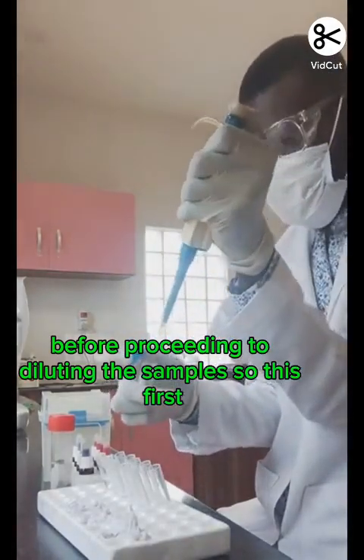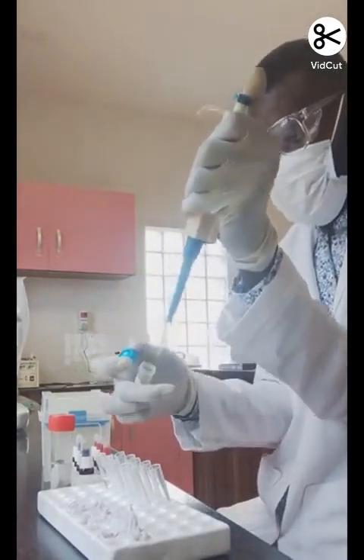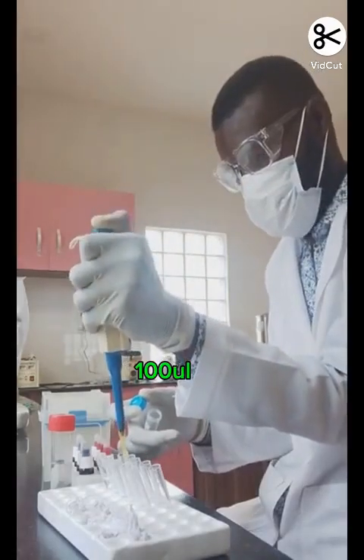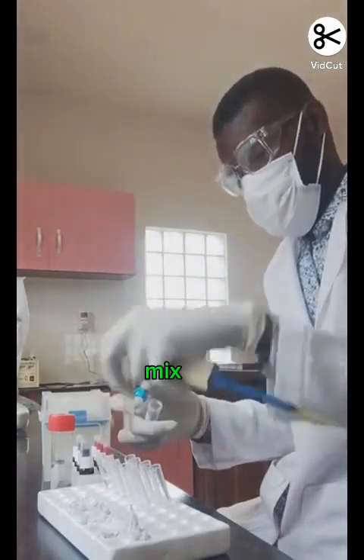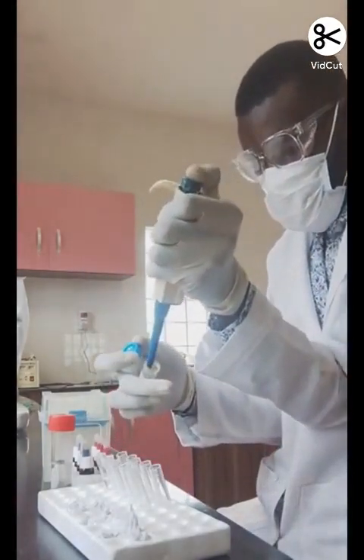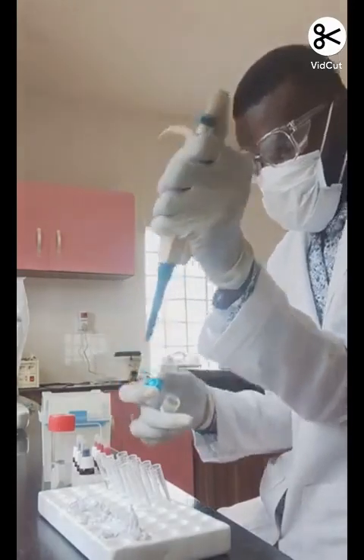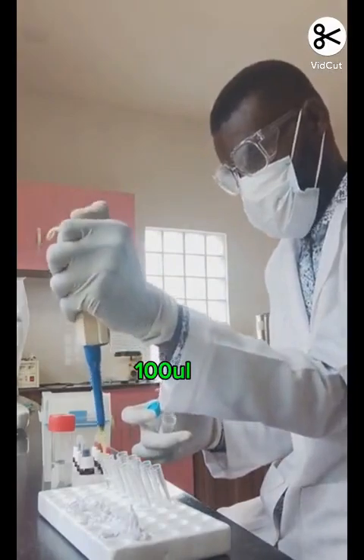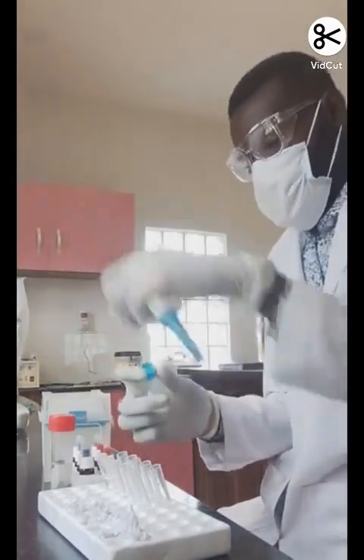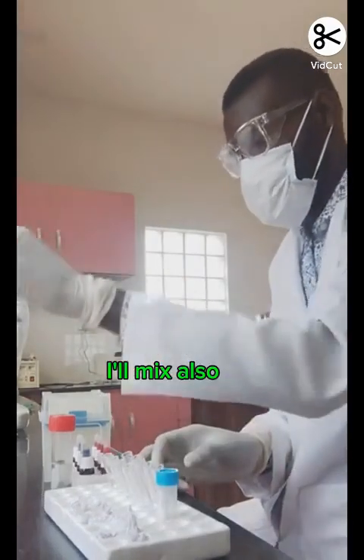So just first 100 microliter. I'll mix also.